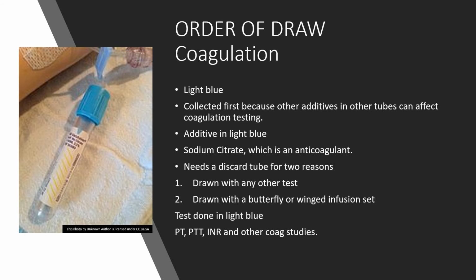which could have devastating effects to a patient who's having real coagulation issues. Okay, so if you're drawing it with a butterfly or a winged infusion set, you would need to use a discard tube if it is ordered with any other test, and our discard tube is a plain red top tube. Now, what are some of the tests that we draw in a blue top tube or light blue top tube? PTs, PTTs, INRs, and a multitude of other coagulation studies.